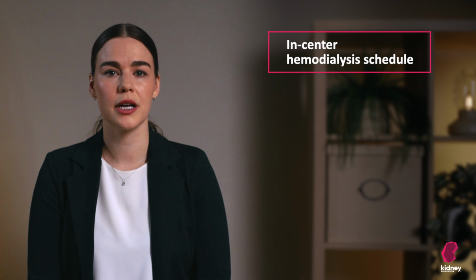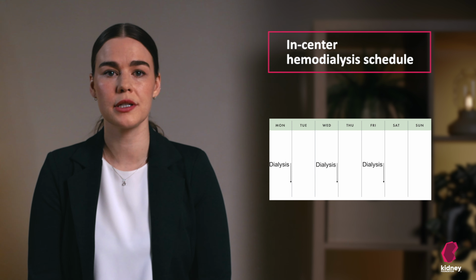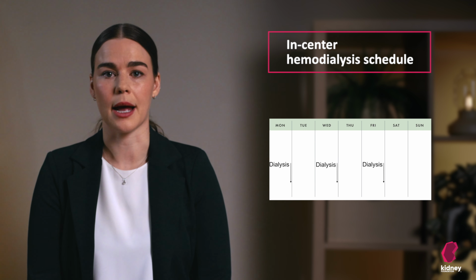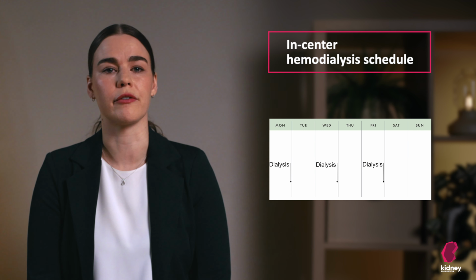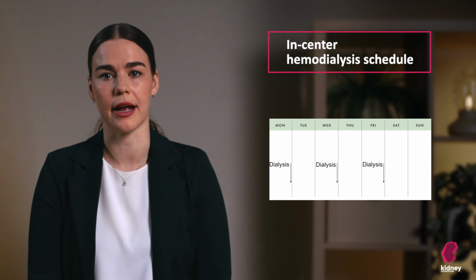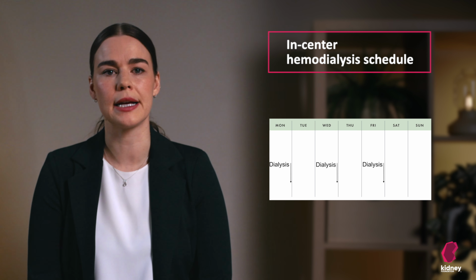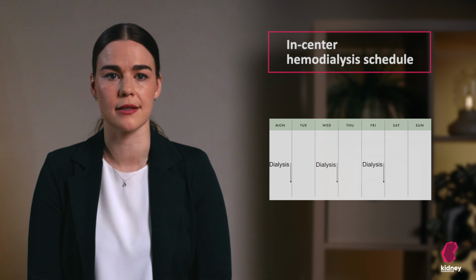The dialysis unit will give you a regular schedule with a time and days of the week reserved for you. For example, you may have dialysis every Monday, Wednesday, and Friday afternoon. The dialysis unit will determine your schedule based on availability and your preferences.